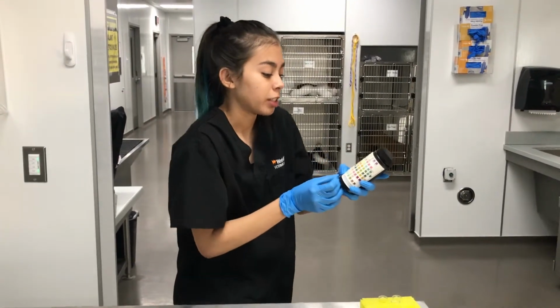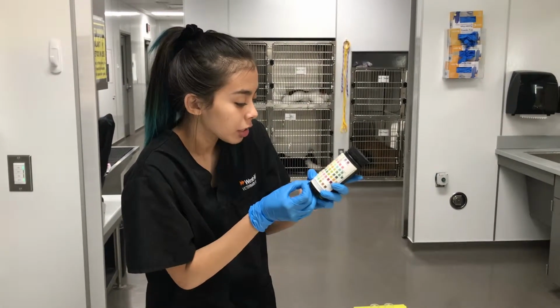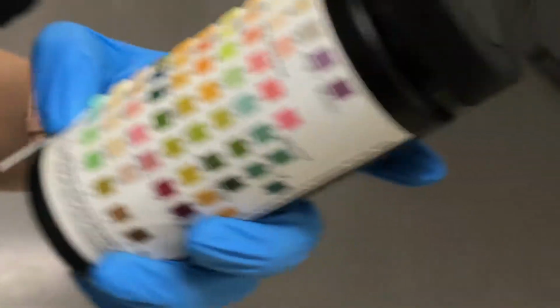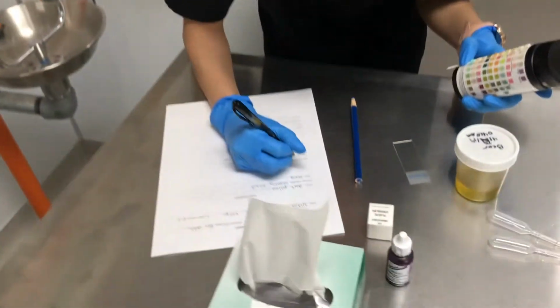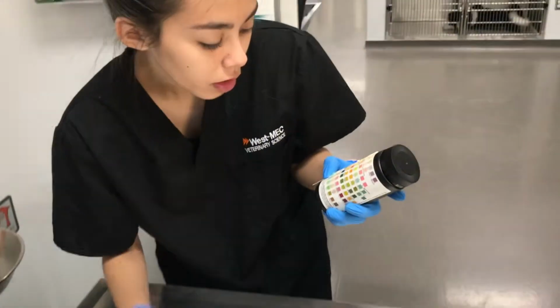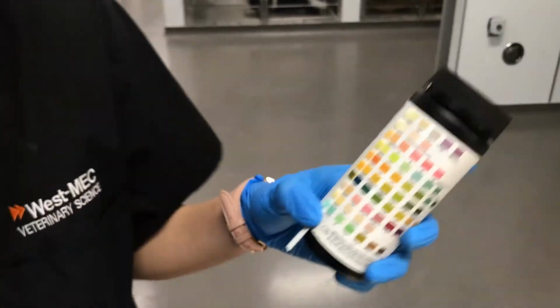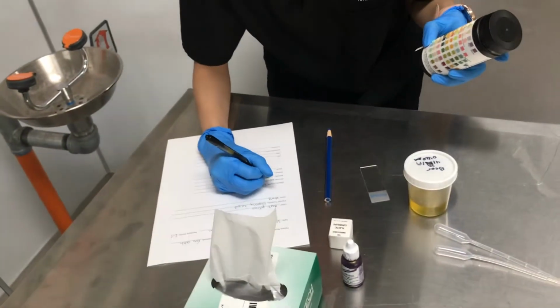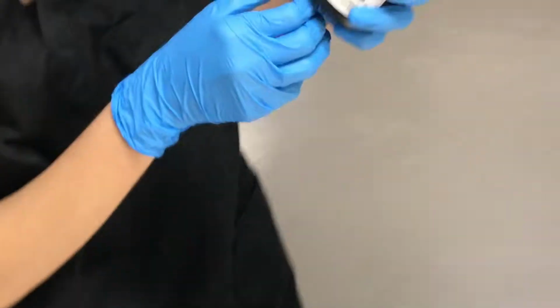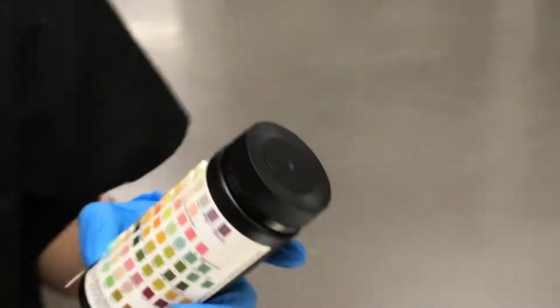So after the 30 seconds are over, I will read glucose and find the matching color to it. And right here, it matches negative. So on the patient's record, I will write negative after glucose. For bilirubin, it reads as negative as well. So I will be writing that on the patient's record. After 40 seconds pass, I'll read ketone, and that also reads as negative.